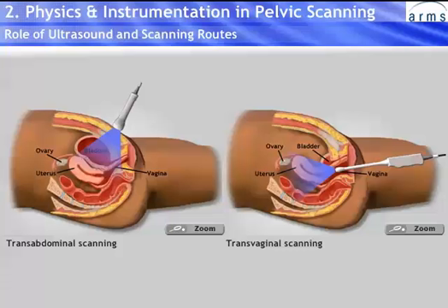Chapter 4 includes extensive instruction in the techniques of pelvic scanning, while this chapter is devoted to the physics and instrumentation of ultrasound.